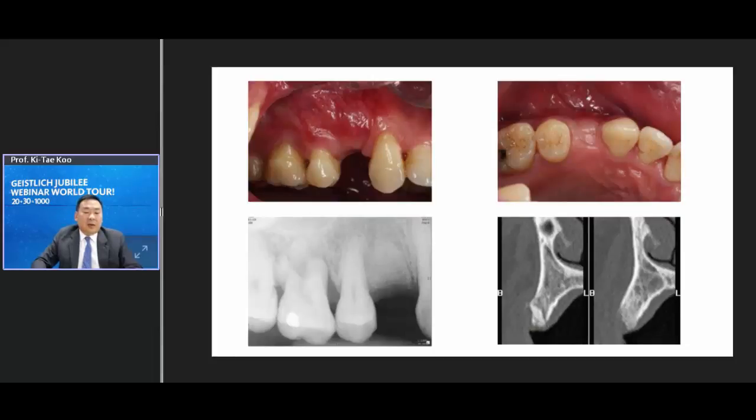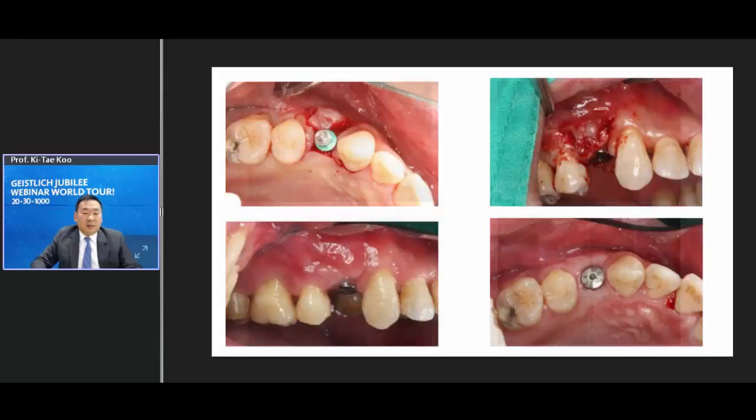And this is the healing you get after 4 months before implant placement. We do see some scar tissue, but it was inevitable because we had to save the papilla on the distal aspect of the cuspid. So we did make a vertical incision, and you can see the volume of the area that is saved very nicely. So this is preserved bone at 4 months, and now we place the implant at 4 months.